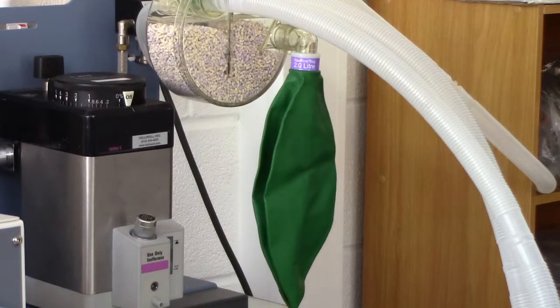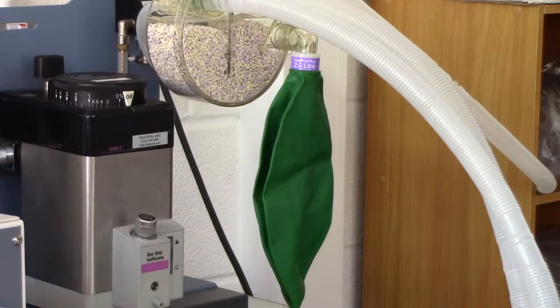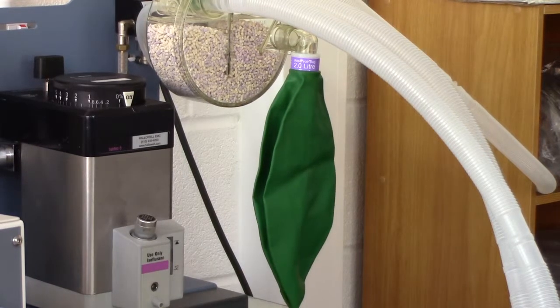Note the periodic filling of the reservoir bag during expiration. This is quite normal.